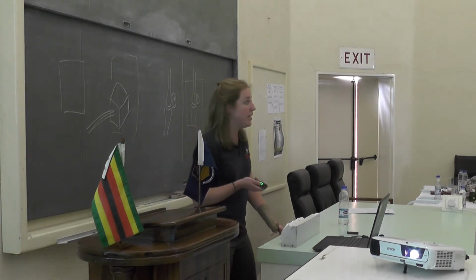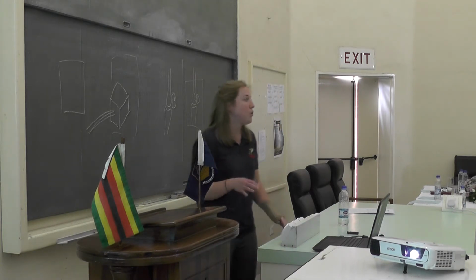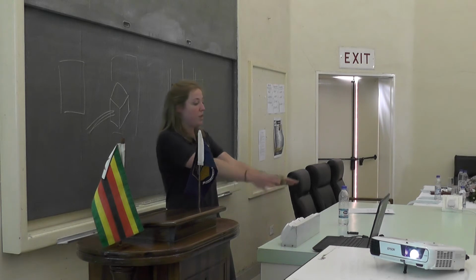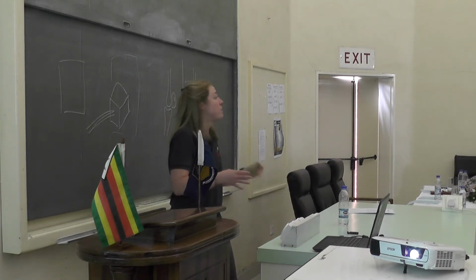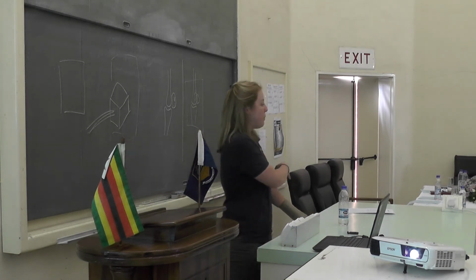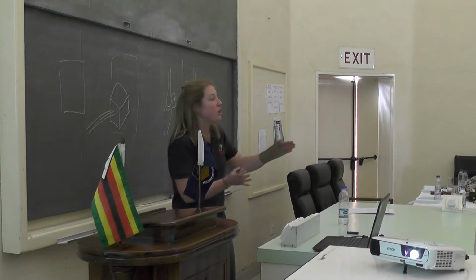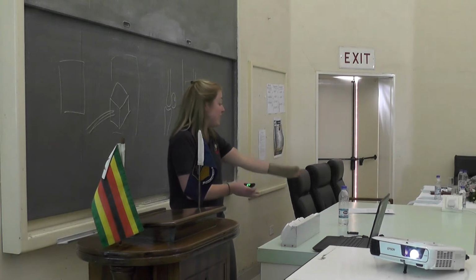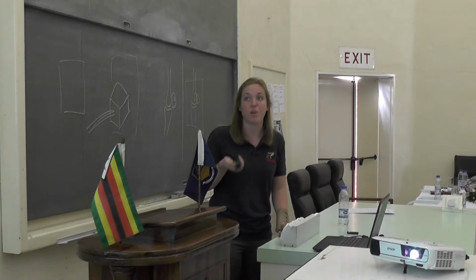But most importantly, you need to look at your patient and the conformation of your patient. So if your animal has its legs completely toed out, for example, you're not going to stand 45 degrees from the body of the animal on the side that is at that angle. You need to adjust. You need to follow that limb that is actually pointing outwards to try to cut the joint at a level that will be perpendicular to it and that will give you a good image. So always adapt to your patient.